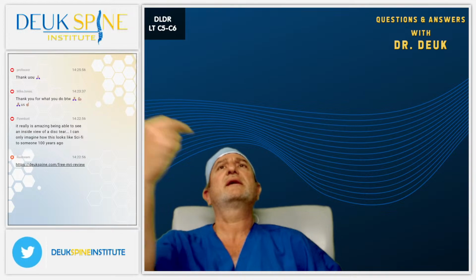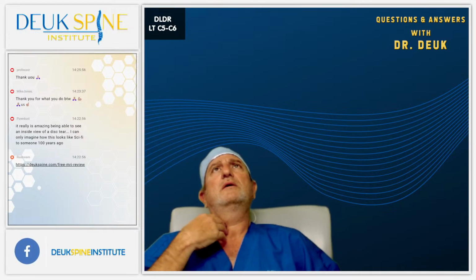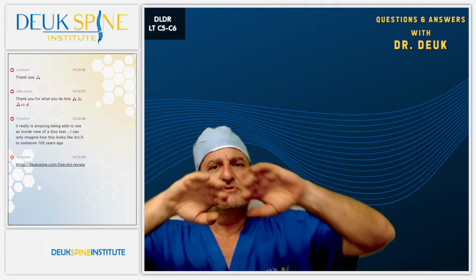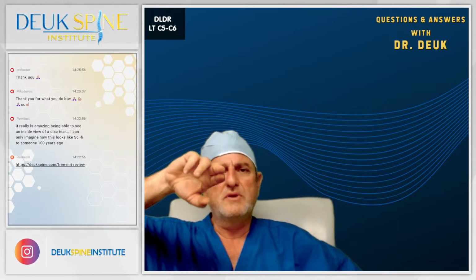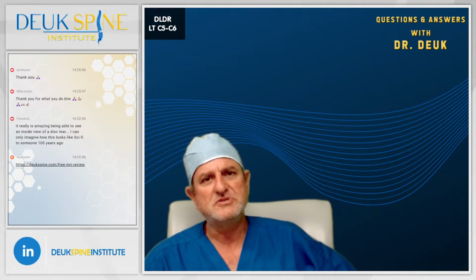You guys are looking down at the neck. I'm taking my fingers, putting them right here, and pushing down and touching the spine, okay? By doing that, I'm spreading the tissues apart, creating a small path between the skin and the spine. How deep is the spine?